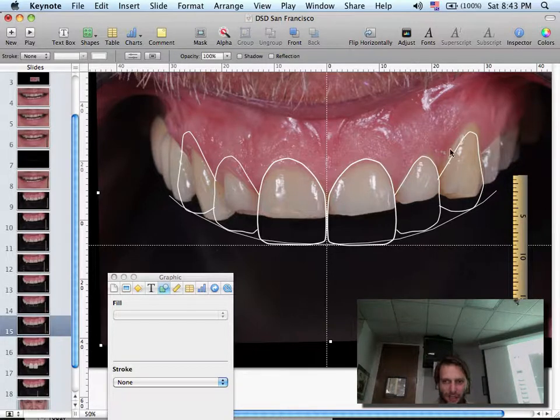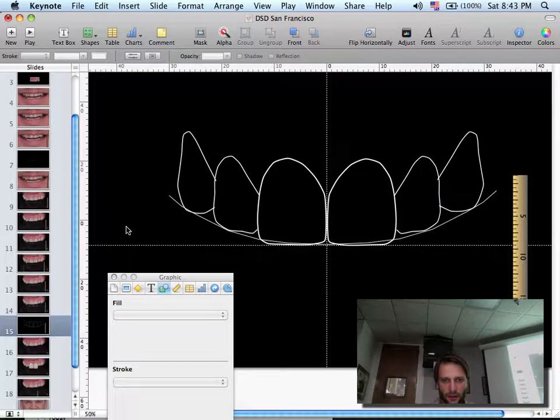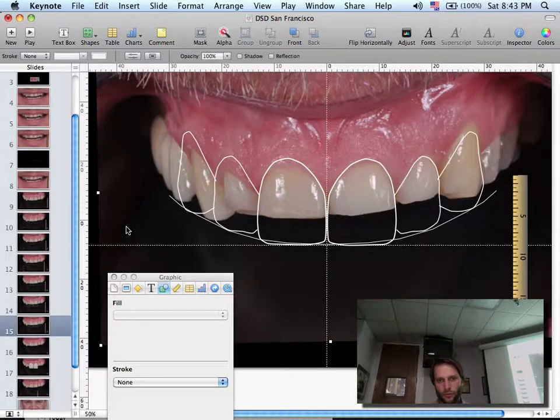So that's the kind of thing that the technician needs to understand to shape them and to try to make a nice balance between the crowns, even though the soft tissue is not even. So again, I can delete this and I can take a look, and it looks pretty good. So that should be my final design.